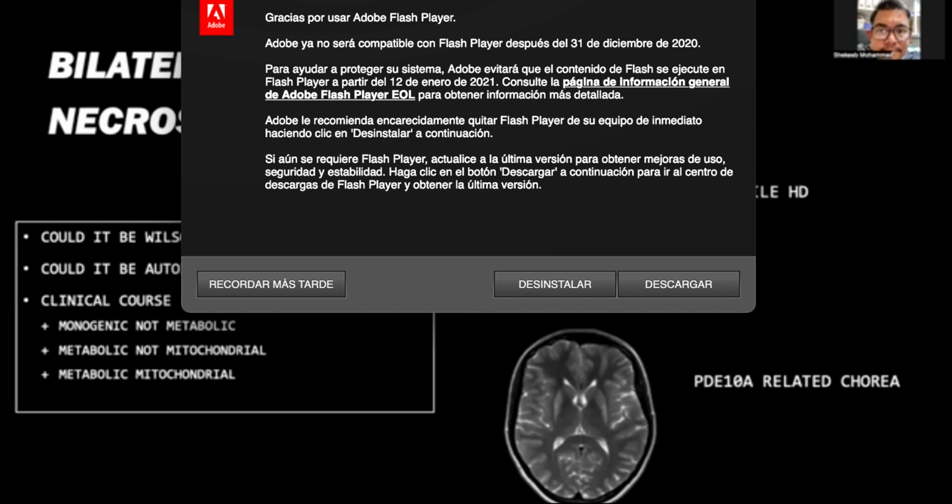Finishing off with the last couple of slides, there is a pattern that's often alluded to as striatal necrosis, though to be honest, this is a pathological term, and the radiological clues can sometimes include atrophy when you have sequential images along with cystic changes, when you can confidently say that this may correlate to necrosis, but you may allude to these as bilateral striatal lesions. Again, these can have a variety of acquired as well as monogenic causes.